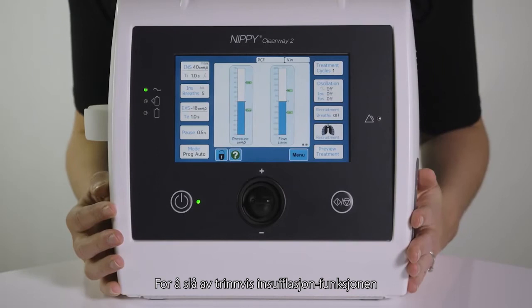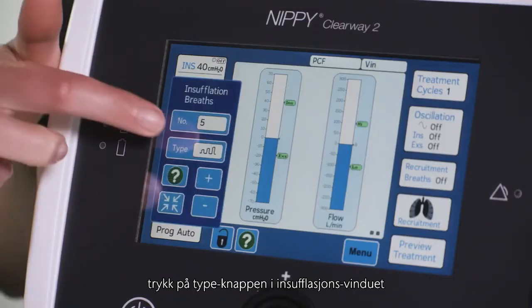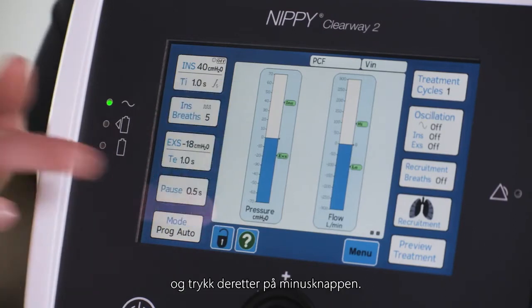To switch off the stepped insufflations feature, press the type button in the insufflation breaths window and then press the minus button.